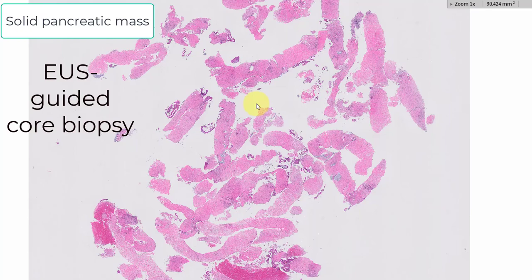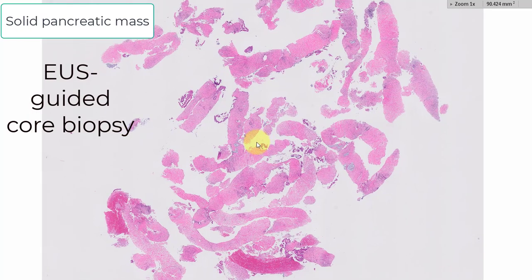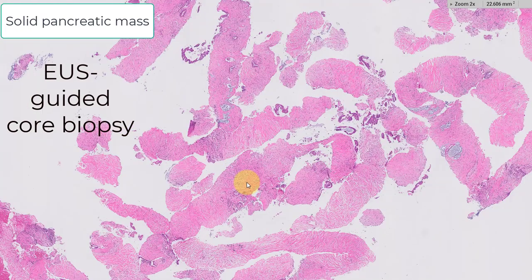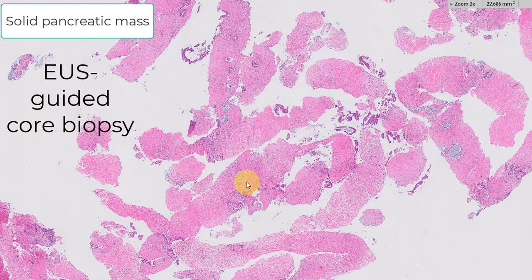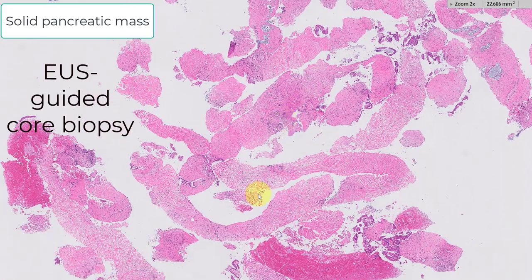This is a pancreatic mass in an elderly man. And depending on whether you see a lot of these or not, it may or may not constitute a challenge.